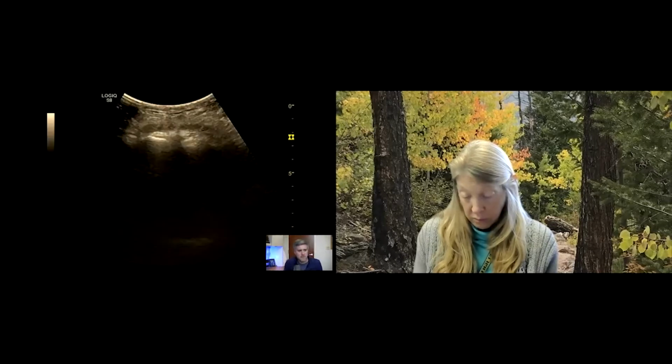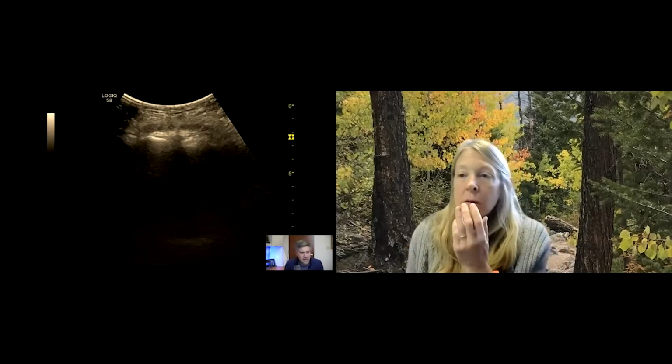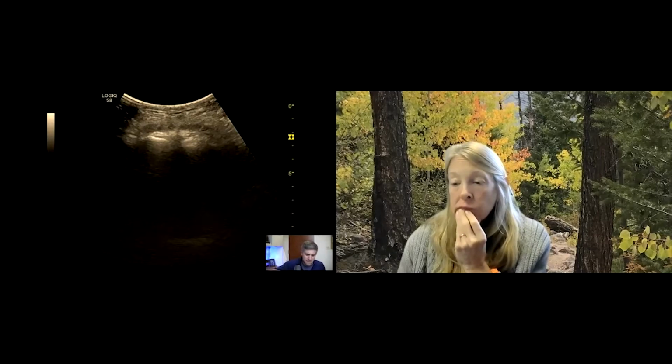And so if we look sonographically, this is the transverse orientation. And I know you don't see a lot there, but if you see those two horizontal bright echogenic lines separated by a small hypoechoic gap right in the middle, that gap, that's the pubic symphysis, right? And so one thing that I like to do to help identify where this bladder is, put my probe down transverse or sagittal, right? I'll show you the sagittal in just a sec, but since we're on this image, put it down in transverse, put that probe on the pubic symphysis. You can feel that little hump as you go up onto the pubic symphysis in that firm spot, and identify that, right?